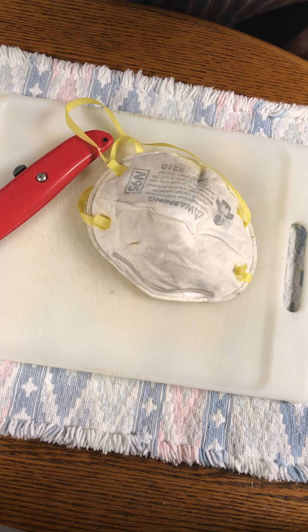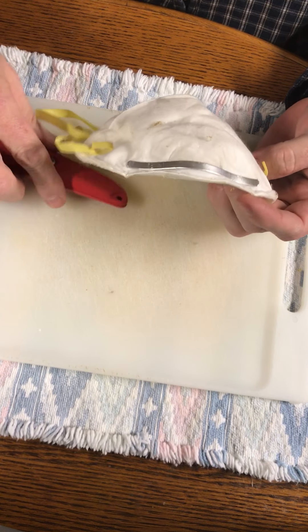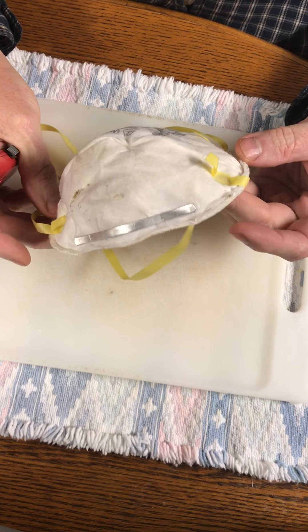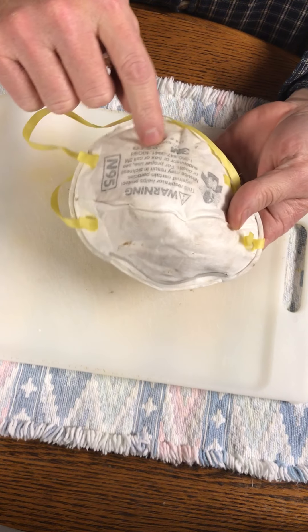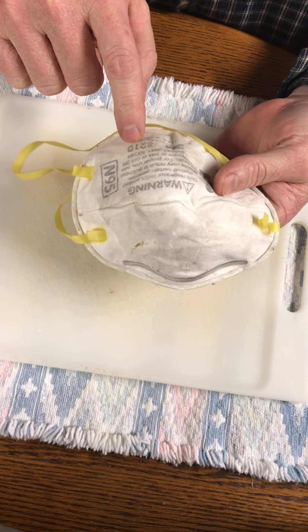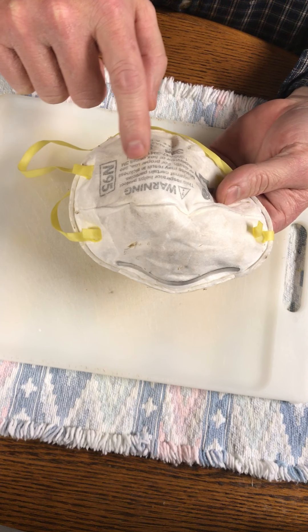This is an N95 mask I had in my shop and I figured I would just dissect it for people who want to know what's inside one of these things. It says N95, 3M - model number 8210 - it's a respirator that protects against particles. Misuse may result in sickness or death.